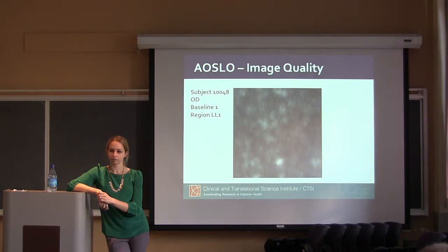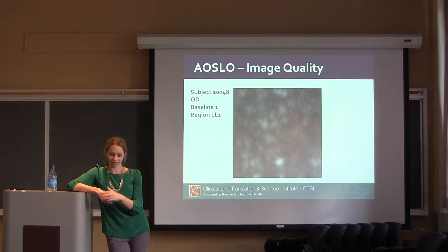So for people with really high refractive errors, tear film abnormalities, cataracts, epiretinal membranes, floaters, systemic edema, there are a lot of things that can make this very challenging in eyes with disease. So it's a lot harder in diseased eyes, even though sometimes they haven't lost all that many cones. The cone spacing might be normal. It's just that they're not all perfectly visible all the time.